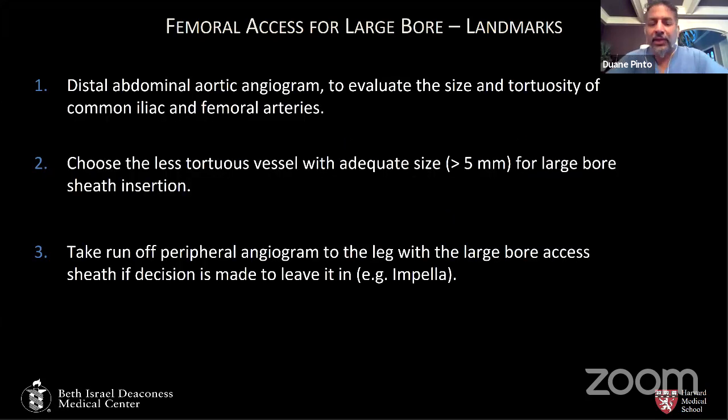So some use what's called a dry closure technique at the end of the procedure, and also utilize a contralateral access to understand angiographically the common femoral artery and bifurcation, as we showed earlier. And this may be necessary in some cases where you're doing an urgent case, there are no CT images, or you just want to know what the artery looks like. In this case, we're going to show what a crossover technique is, but you can put a wire down the common femoral artery, and that gives you a third method for localizing the artery, which is under fluoroscopy, you can see the needle and or take a puff and see.